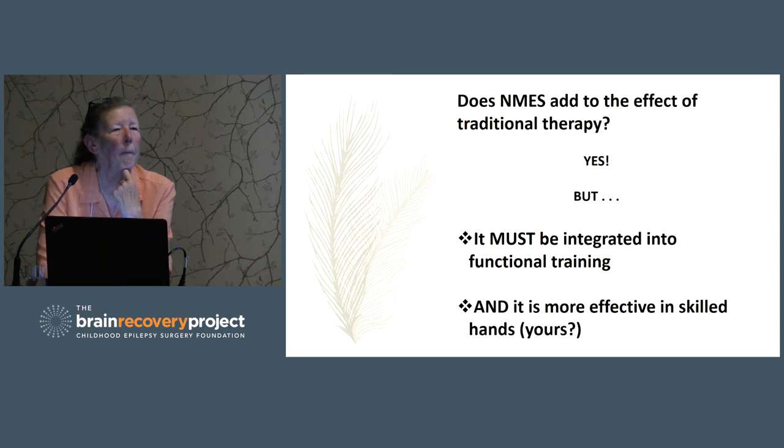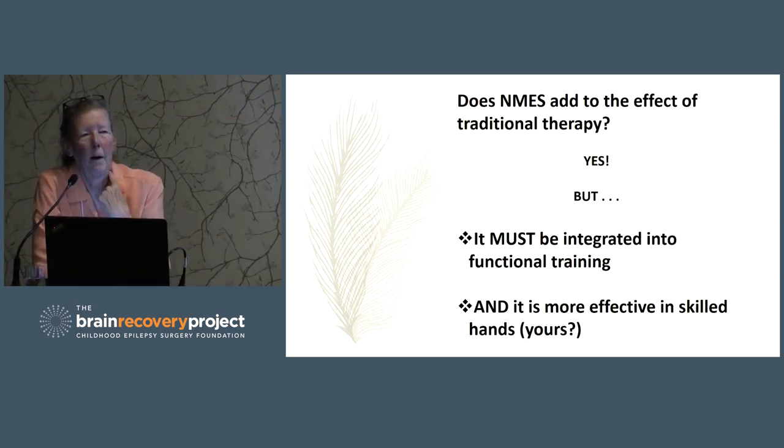What about electrical stimulation for individuals that are older? For instance, someone that had a hemispherectomy in 1981, when they were 1. Okay, so older patients are no different. Actually, the majority of the research has been done in stroke patients because they're a relatively homogeneous population and they have similar kinds of problems across the board. So the majority of the work in electrical stimulation from the 70s forward has been in stroke patients, some in spinal cord patients, but most of it in stroke patients. It works very well. They need strengthening programs a lot of times, especially if it's been since 1981. They probably have pretty wimpy muscles. So you have to build up some strength, and then once you've got strength, you can start looking at it in a functional way and make a decision about whether you can make it functional enough for them to use without the stimulation or whether you're going to need a long-term stimulation program.